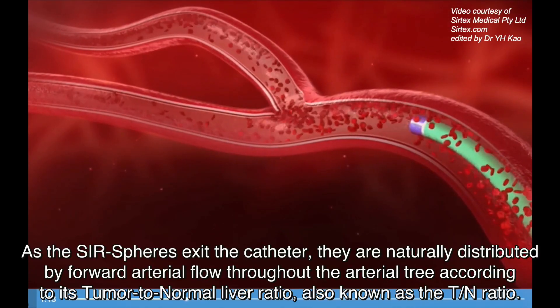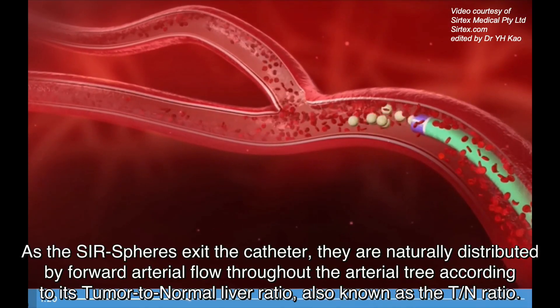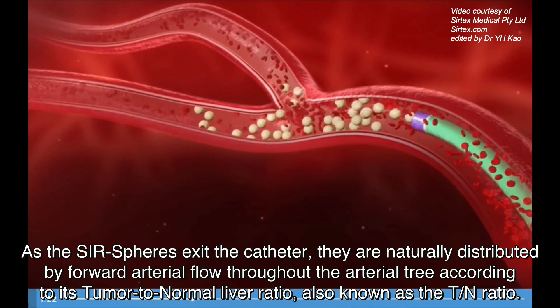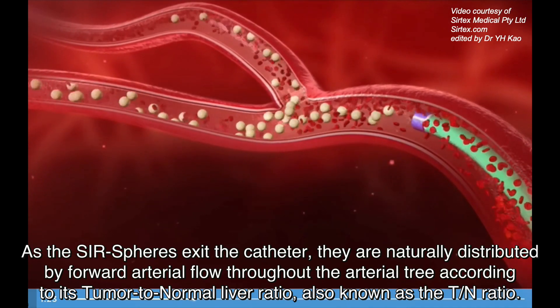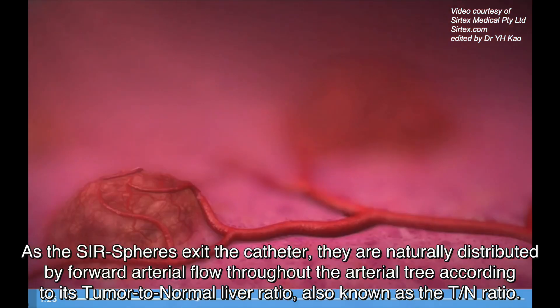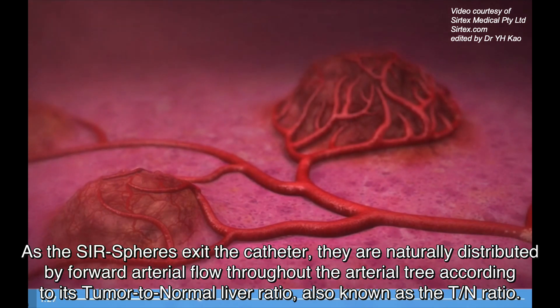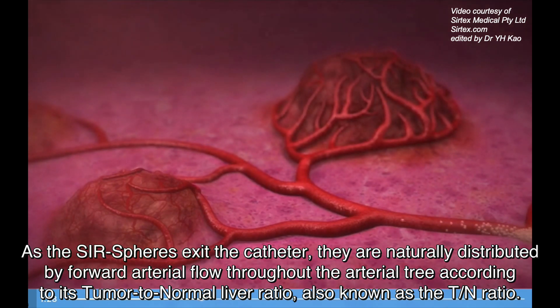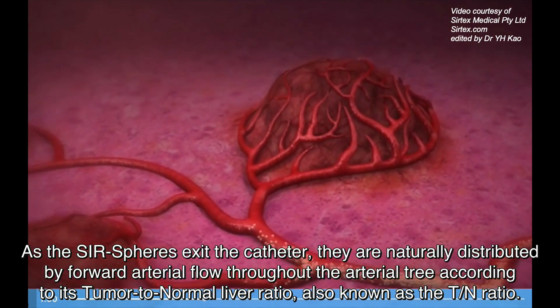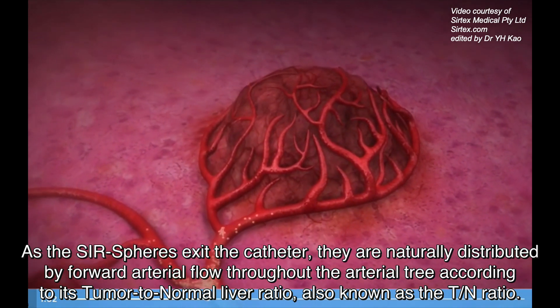As the SIR spheres exit the catheter, they are naturally distributed by forward arterial flow throughout the arterial tree according to its tumor-to-normal liver ratio, also known as the TN ratio.